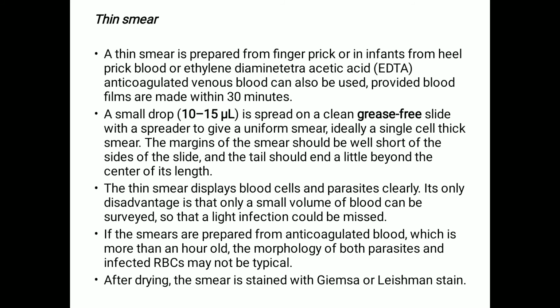So how will we report this thin blood film? In case of malignant tertian malaria, only the ring stage and gametocytes are seen in the peripheral smear, while in benign tertian malaria, all stages of schizonts and gametocytes can be seen.